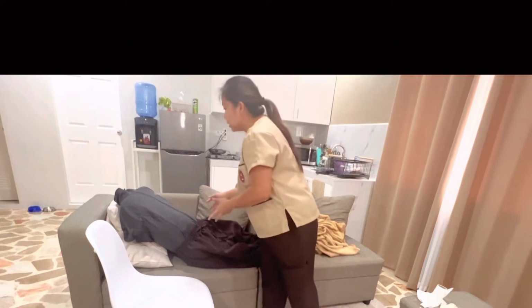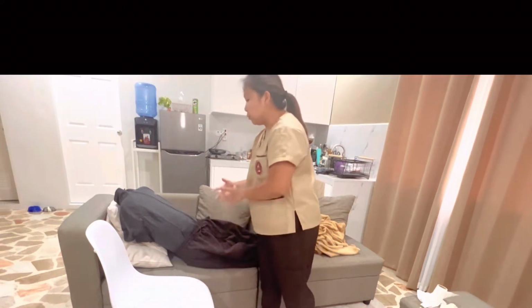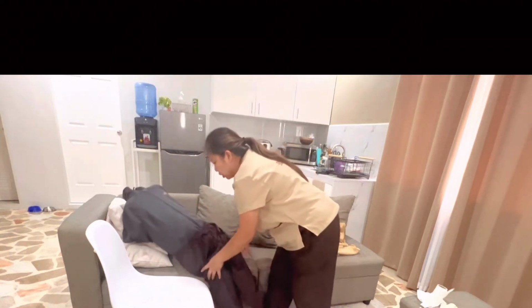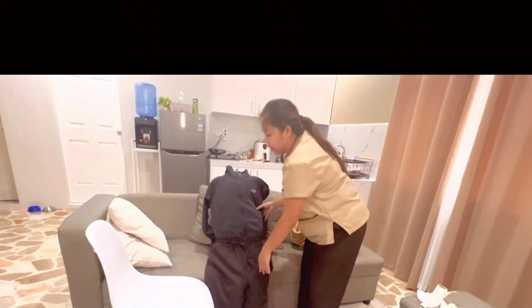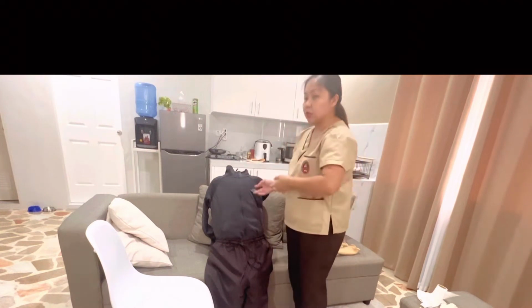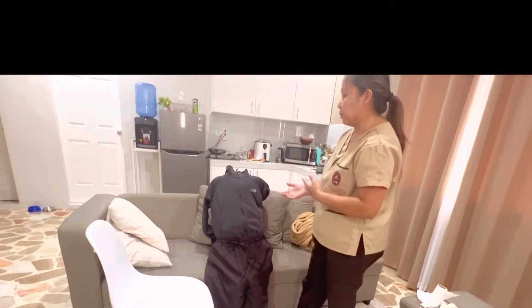So ma'am, I will be assisting you to get yourself ready so that you will be standing up, and then we could transfer you to the commode, okay? So just assist the patient to sit at the edge of the bed, and then this patient is ambulatory based on my chart, so she'll be able to get up by herself. Just offer some assistance if needed.